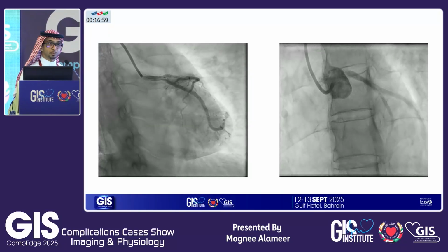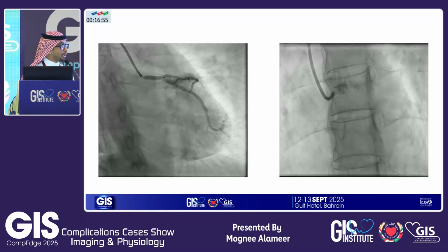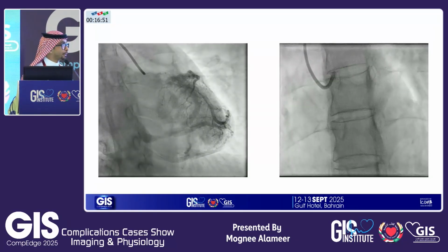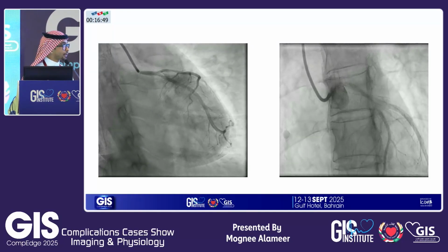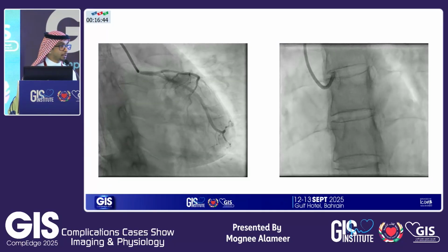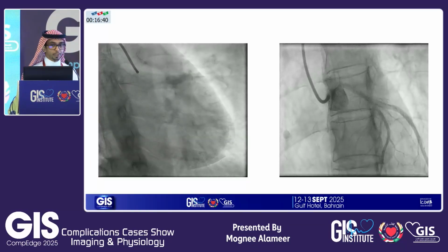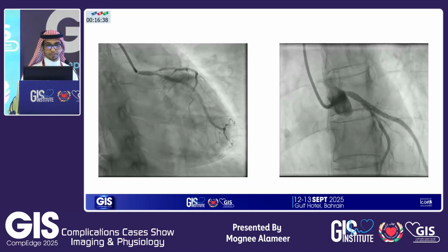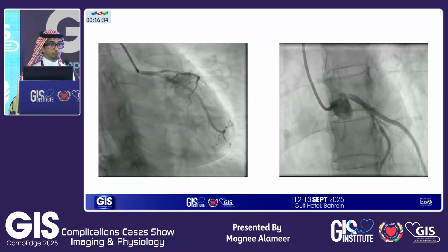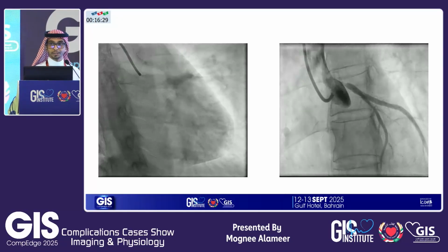So in my mind came 2 differential diagnoses, either SCAD, but now it's almost 6 weeks after the first angio, so unlikely. Usually SCAD should be healed by this time. The second possibility is a real plaque. The patient is young, 46, no risk factor except smoking, but it could be. So then what to do? Just send for surgery, do stenting, it's ostial left main, or do imaging just to confirm.